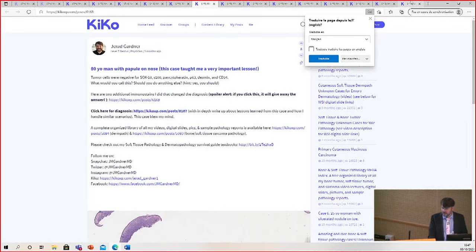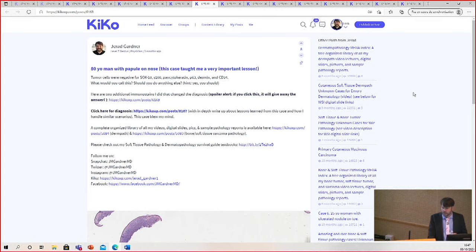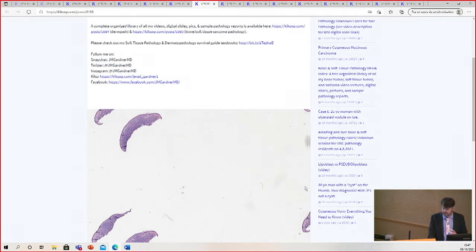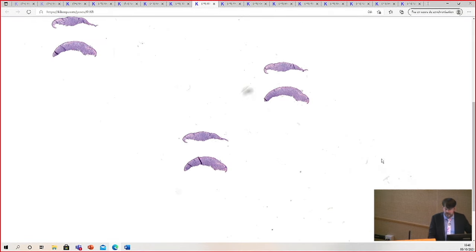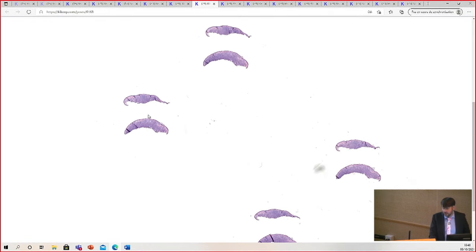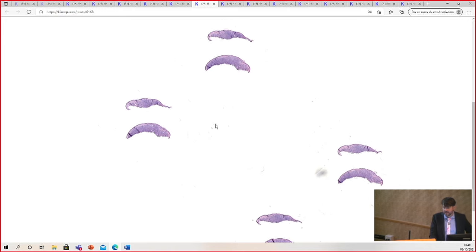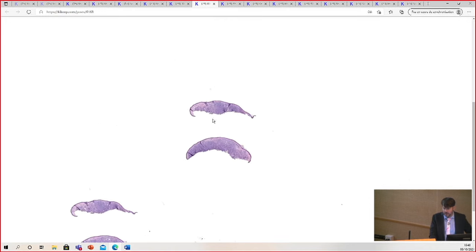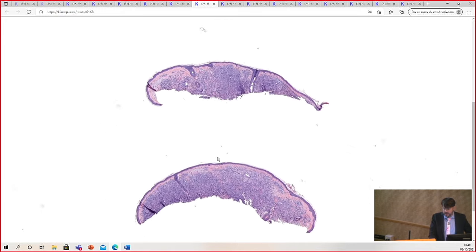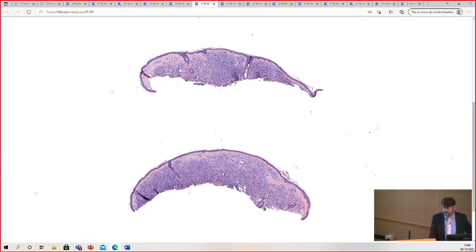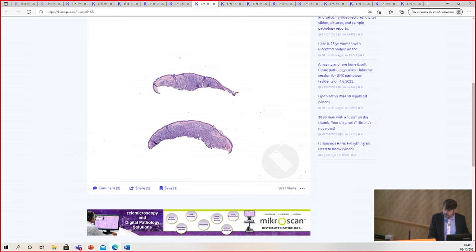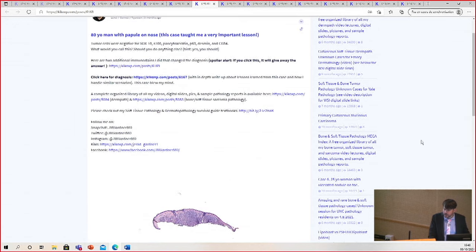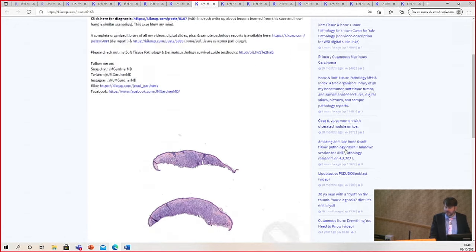This is a case that taught me some very important lessons. This was sent in by a colleague who's a good dermatopathologist. This is from a papule on the nose of an 80-year-old man.